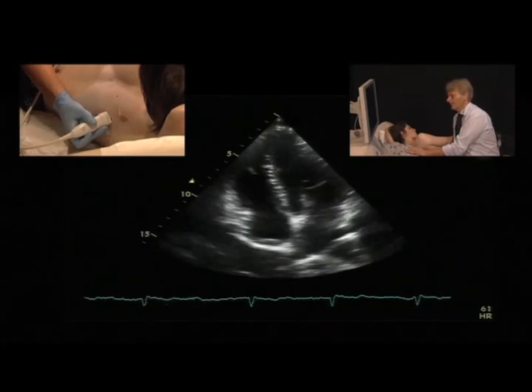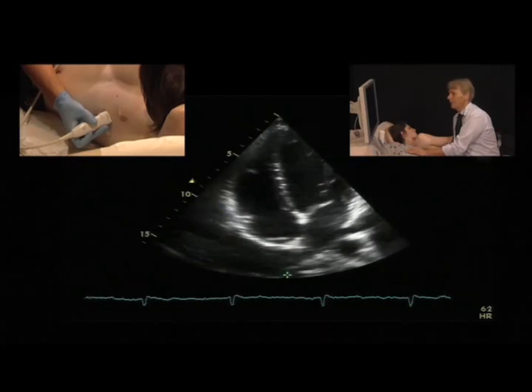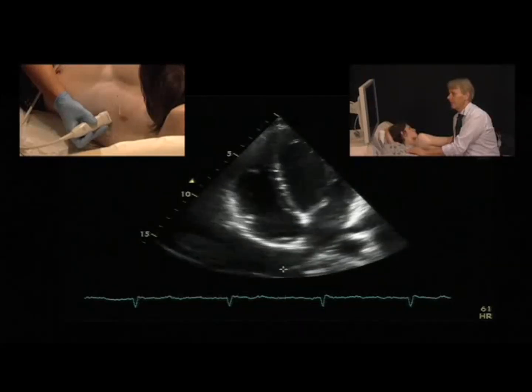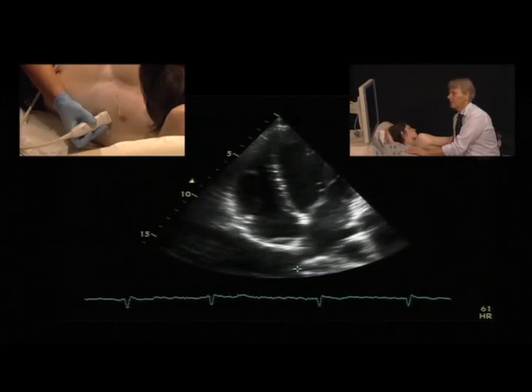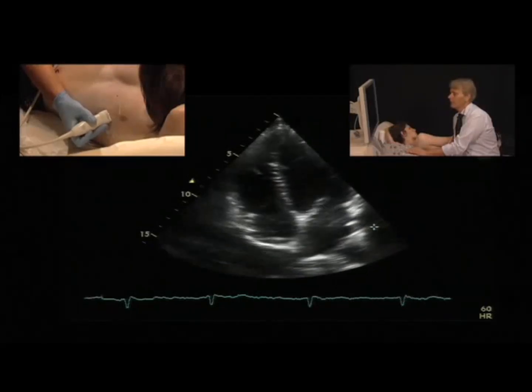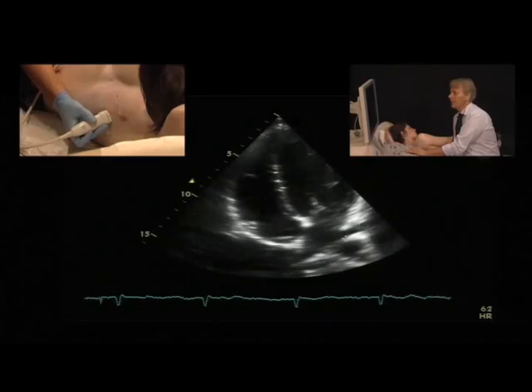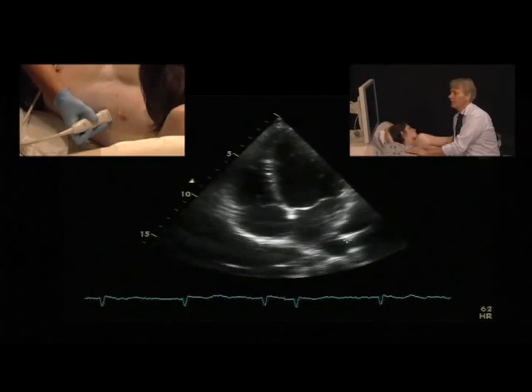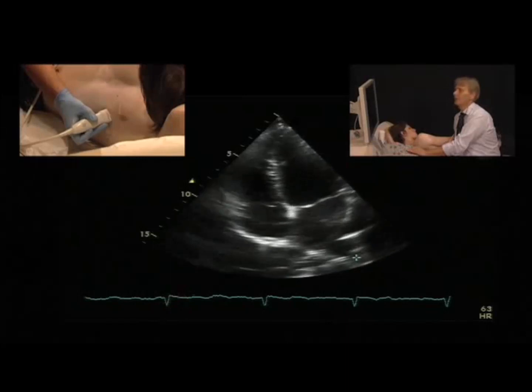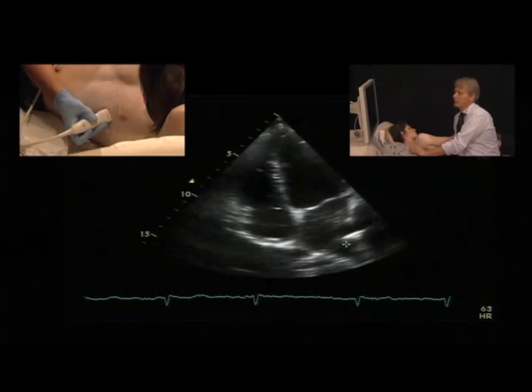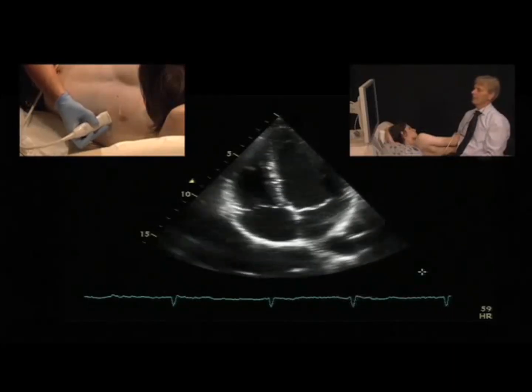Going into more detail, we can even see the pulmonary veins as they enter the left atrium — the right upper pulmonary vein, the lower and upper left pulmonary veins. You would also see the descending aorta, orthogonally visualized, in this view.